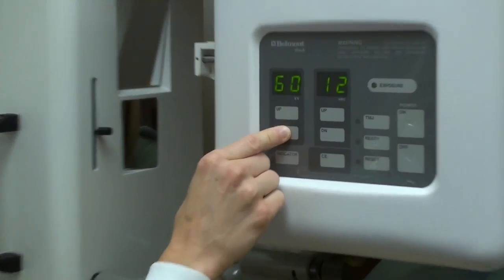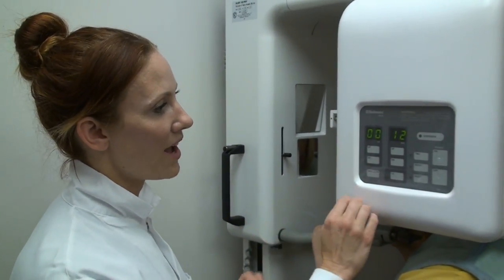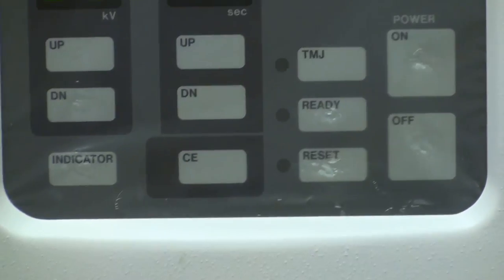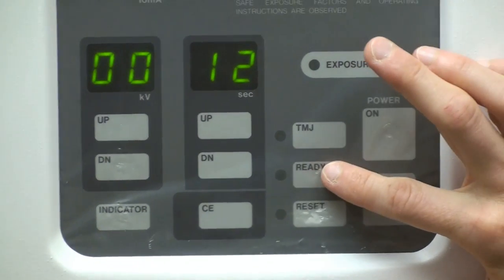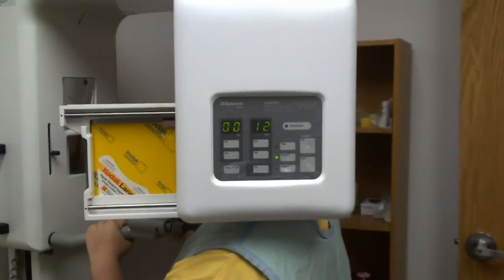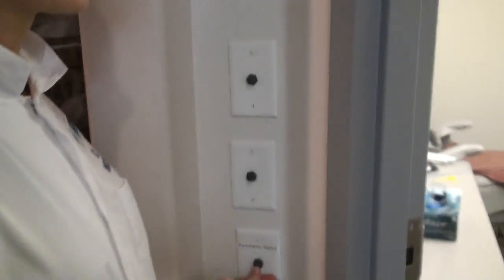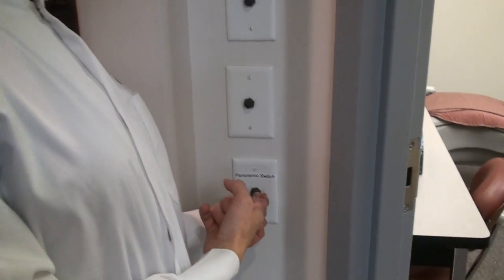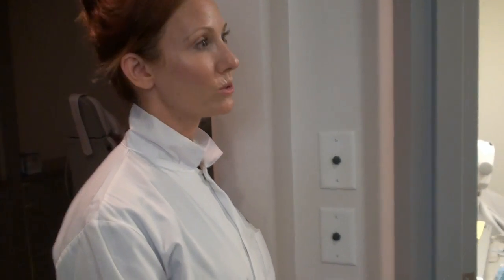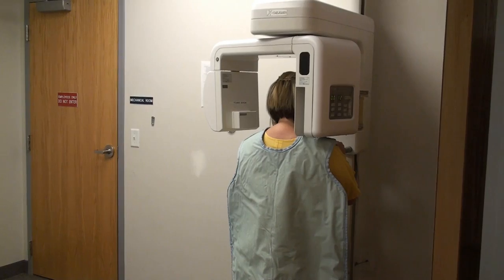When working on each other, hold the KVP all the way down to 0 because we don't want to actually irradiate each other. Push reset and let it do its thing — it's going to get into position. Lindsay, hold nice and tight. When you push ready, it's going to start getting ready. Tell the patient: put your tongue to the roof of your mouth and swallow, hold real still, this is going to move all the way around your head for about 12 seconds. Hold the button down the entire time — if you let up on it, it will stop and you have to do the entire process again. Watch your patient, make sure they're doing okay.